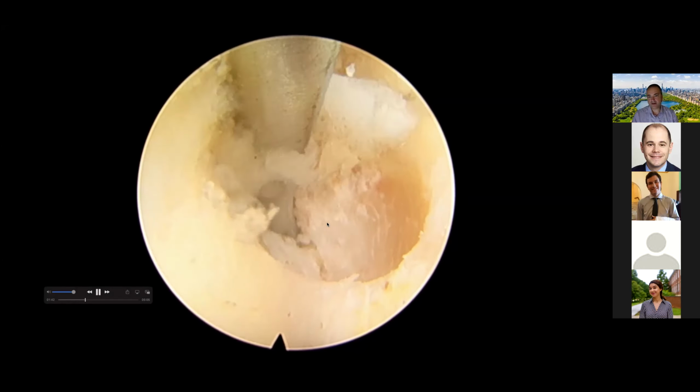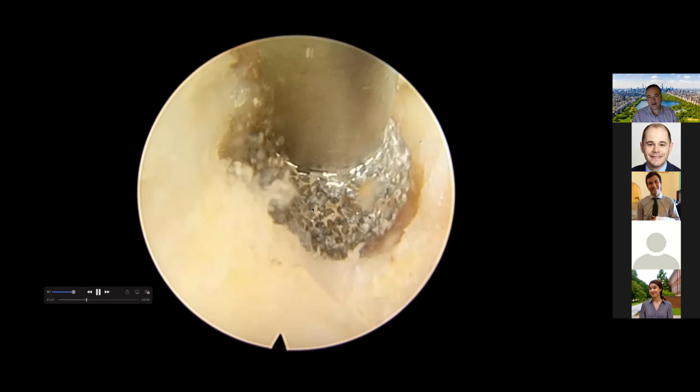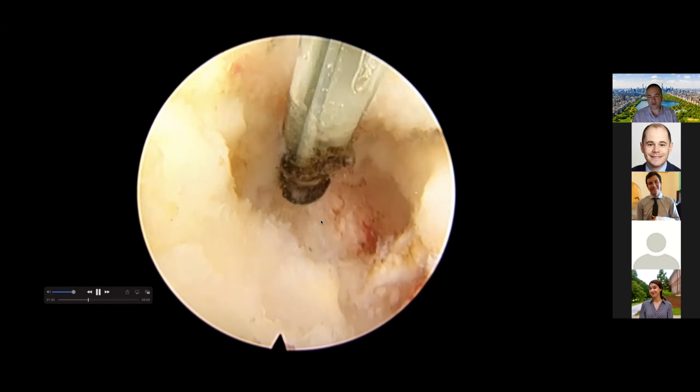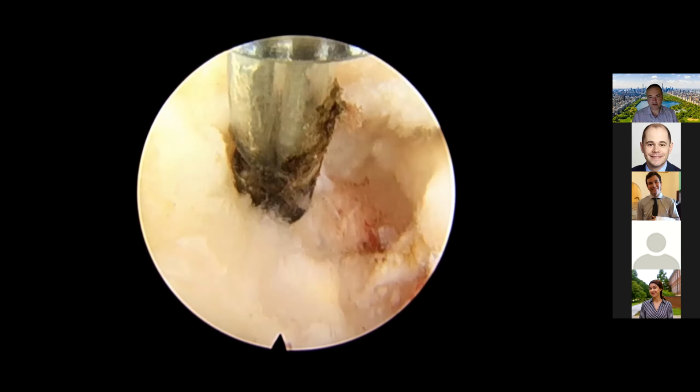Over here, we have thinned the bone, and we're using that instrument to break it. And again, a little bit more drilling. So you see that everything became very wide. It's because the drill is cutting the bone, and the fluid gets filled with little bony pieces.